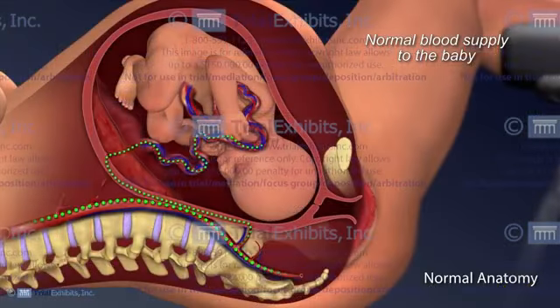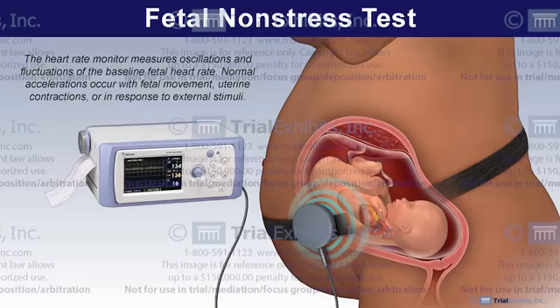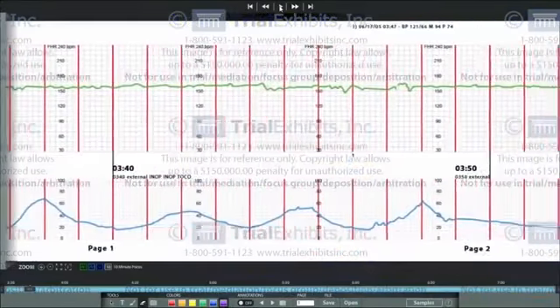This comprehensive presentation of the evidence, along with our illustrations and animation, helped to make it clear that the injuries in this case occurred long before the vacuum extraction was attempted.